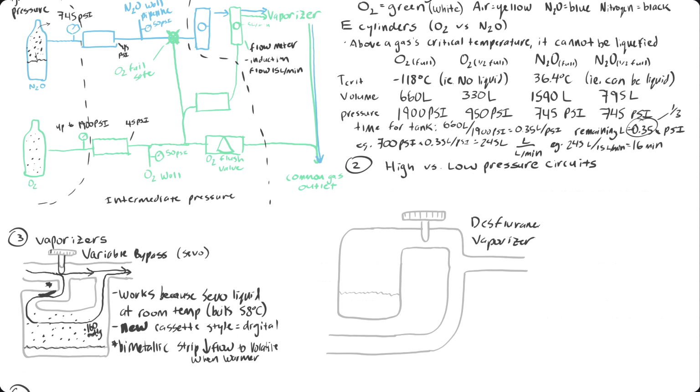So the DES vaporizer is a little bit different because DES is troubling in that its boiling point is very close to room temperature. It's 23.5 degrees Celsius. So if you put DES in here, it'll all boil out essentially, and you'll have no liquid phase here. So instead, for DES, we heat it to 39 degrees Celsius, and we pressurize this container so there's a liquid phase still. And then there's going to be DES in the gas phase pressurized to 2 atmospheres above.